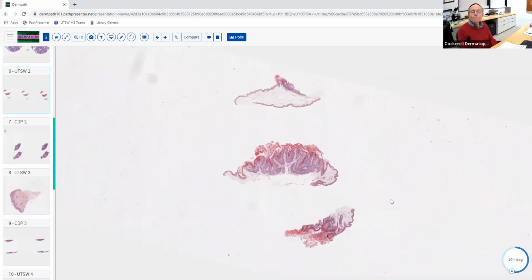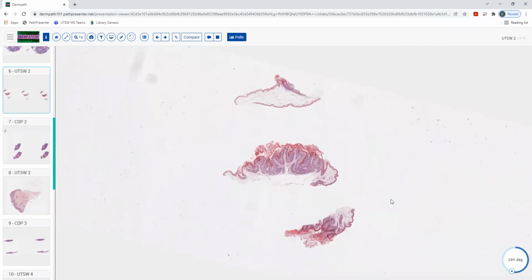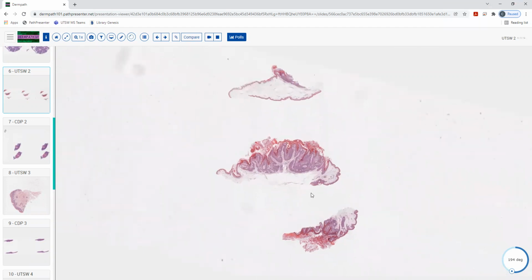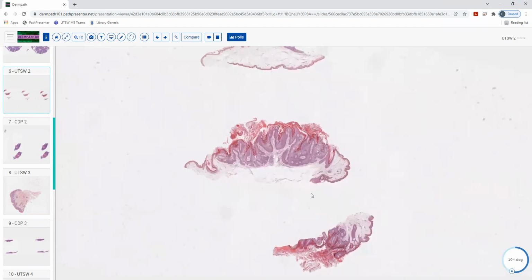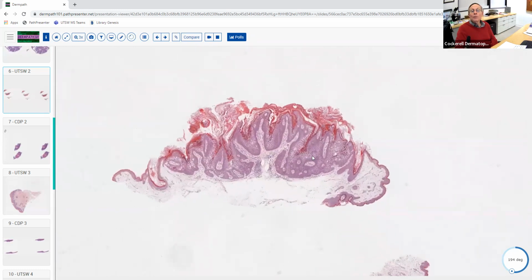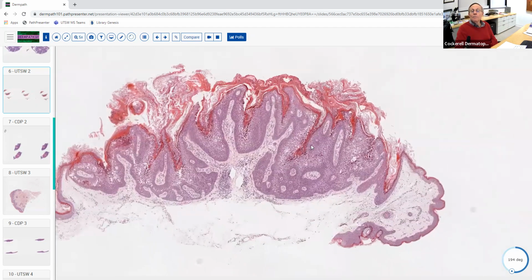Good. So we have a shaved biopsy of a papillomatous appearing lesion. Good. Looks kind of crusted on scanning. And if you zoom in, it's nicely well circumscribed. I kind of felt like it was probably a little benign growth. Yeah, good. It's very small, isn't it? Mm-hmm. And obviously symmetrical and all those kind of things, and it's epithelial. And yeah, we'll go to higher magnification.